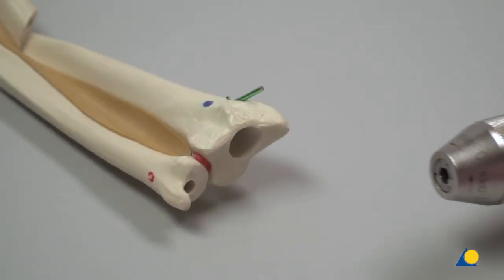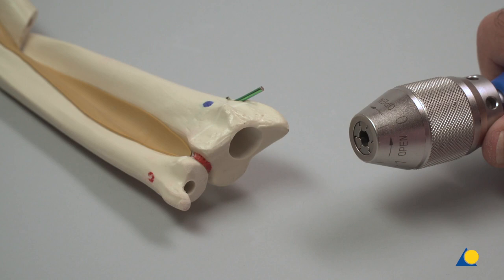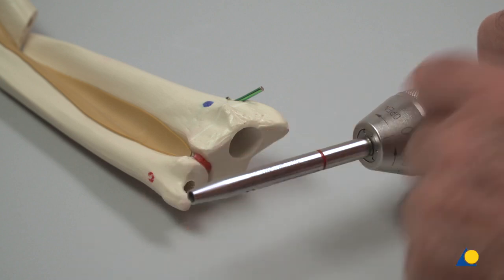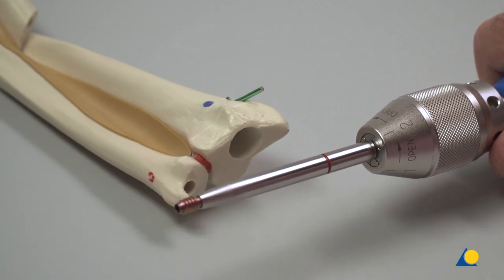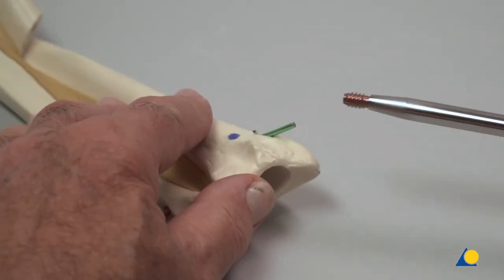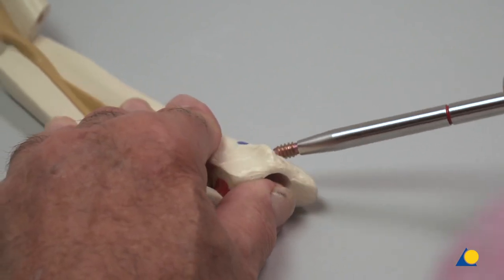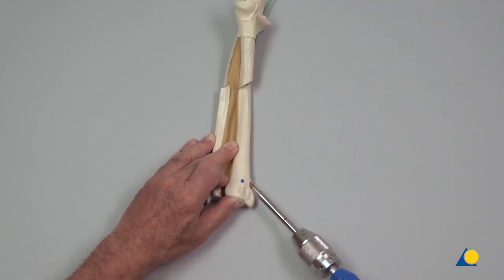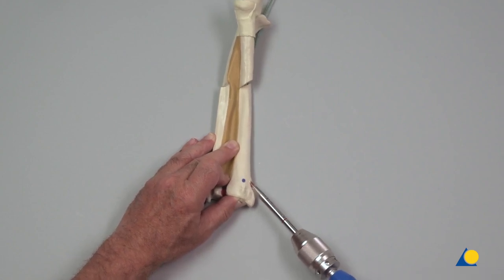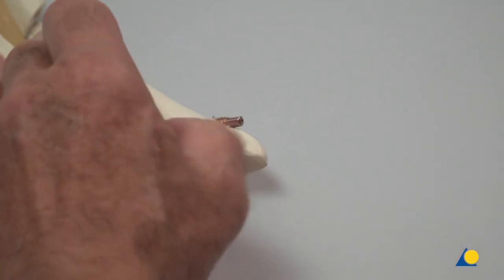The use of small TEN end caps is recommended to provide additional stability in unstable fractures and has the additional advantage of preventing soft tissue and tendon irritation. The screwdriver shaft is inserted into the inserter and tightened. The end cap is mounted on the screwdriver shaft by aligning the D-flats, placed over the nail end, and threaded clockwise into the bone at the entry site. The threaded portion of the end cap directed toward the bone must be fully inserted.